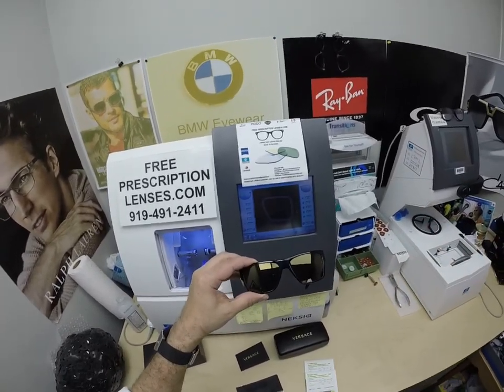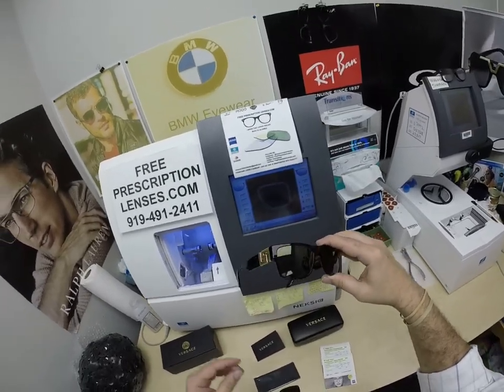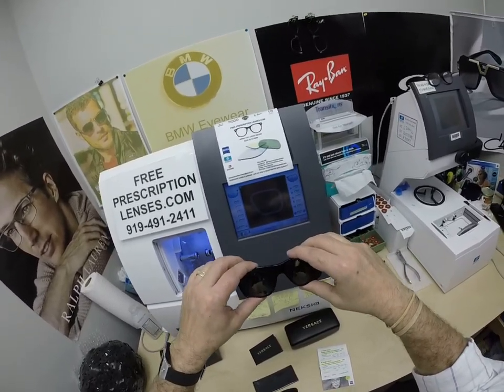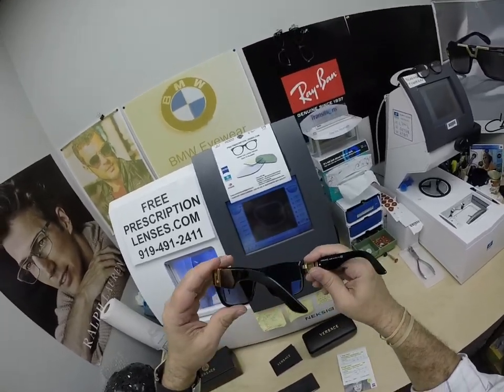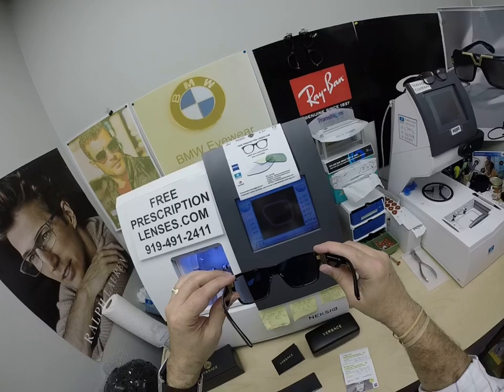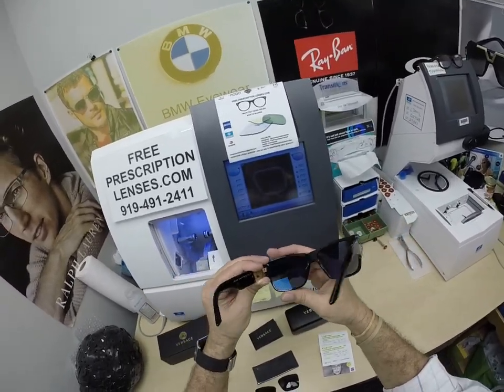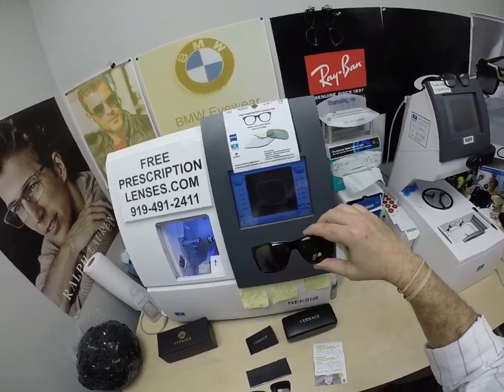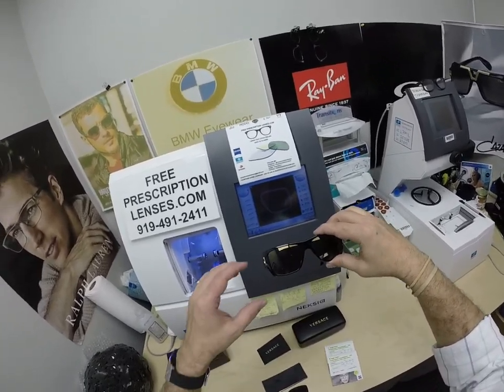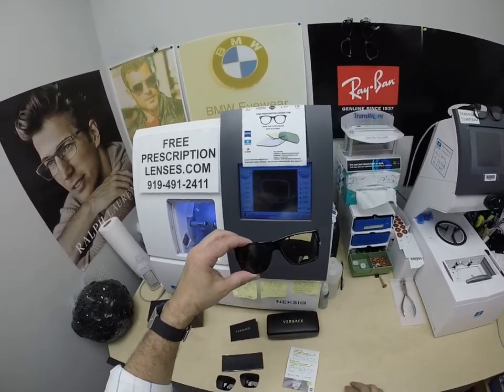These Photofusion Extra Gray are designed for extra active people who spend extra time outside, and these will get darker in hotter weather. They also block 50% to 70% of the harmful blue light emitted from today's electronic devices such as cell phones, tablets, computer screens, and more. The regular Zeiss Photofusion Gray, Brown, Green, or Blue blocks 30% to 50% of the harmful blue light.